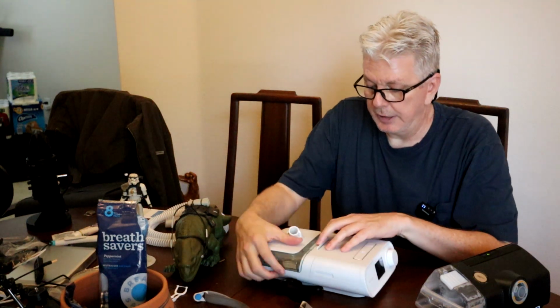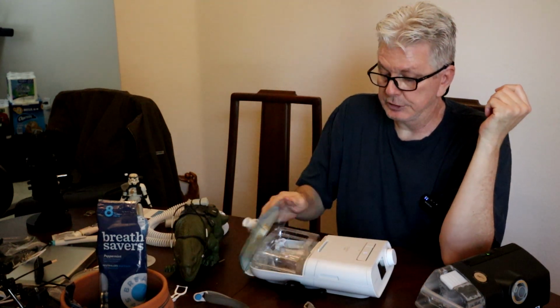This is a kind of flat, slender one for the Philips, and the water chamber on this one I really like. I do have a favorite when it comes to the water chambers, because this one is my favorite. You can put it in the dishwasher, and to get it in and out is so incredibly easy. You just pull this little lever down to release the lock, lift this up, and then pull out the water chamber.